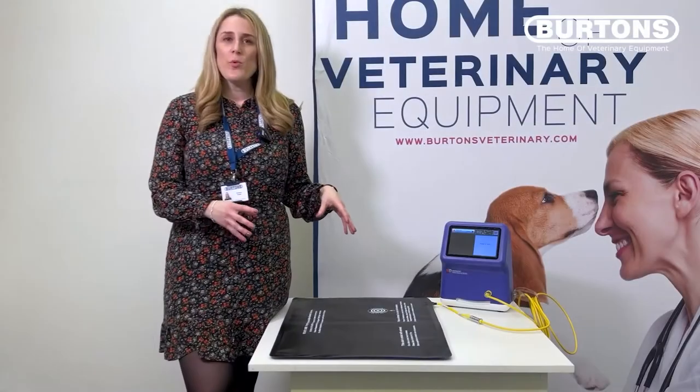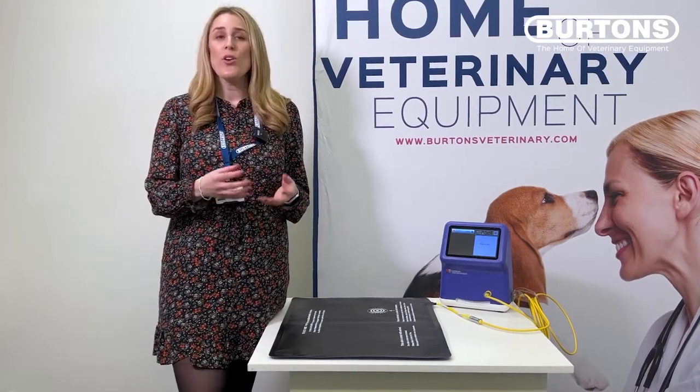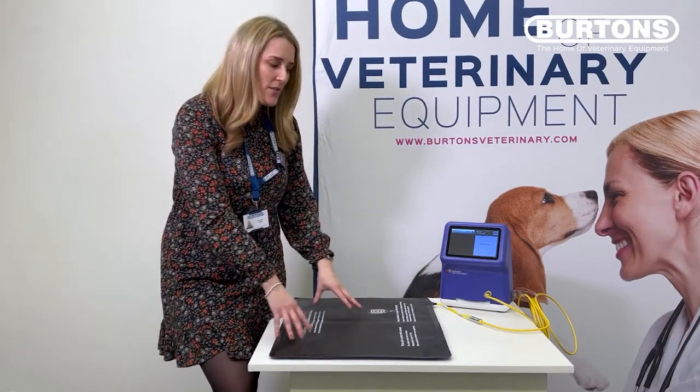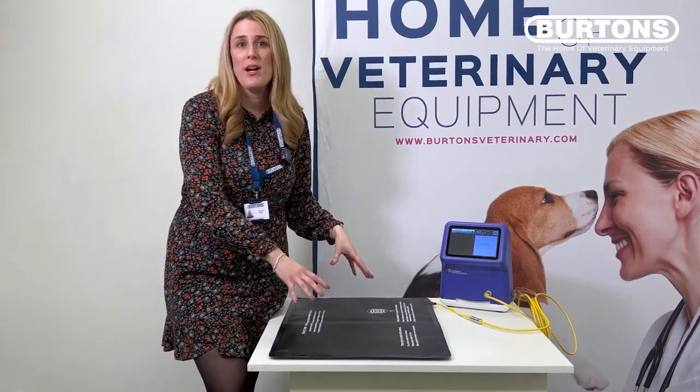The Hot Dog Veterinary Warming System is unlike any other warming system on the market. It is one of the most durable and cost-effective systems, with conductive fabric in their heat mats that allows for even heat distribution. We're not going to get hot spots or pressure points when we use this mat correctly.